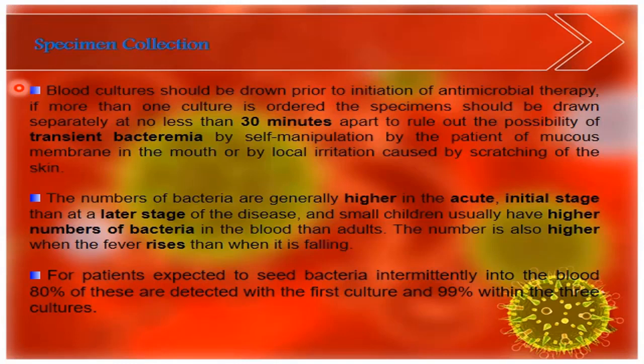If more than one culture is ordered, the specimens should be drawn separately, no less than 30 minutes apart, to rule out the possibility of transient bacteremia caused by self-manipulation of the mucous membrane in the mouth by the patients, or by local irritation caused by scratching of the skin.